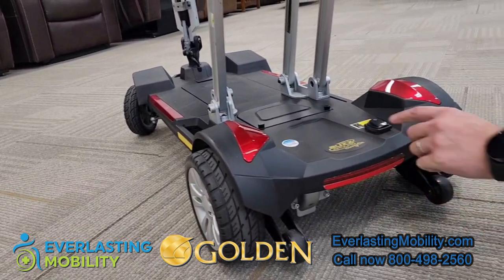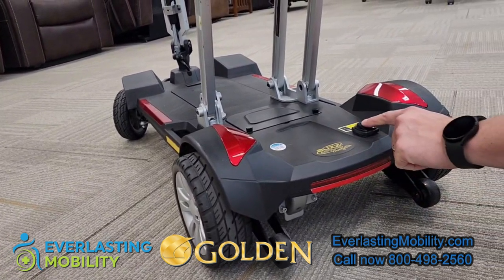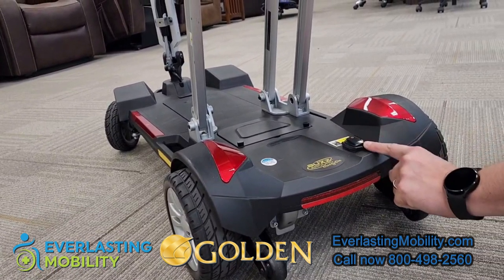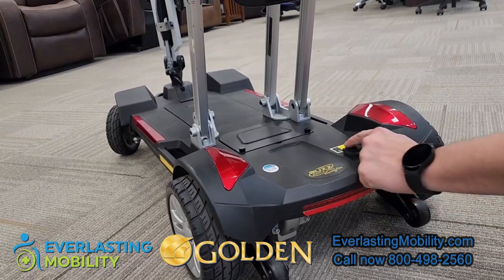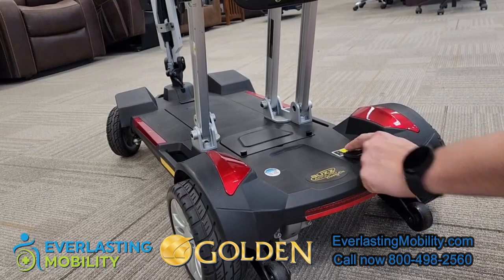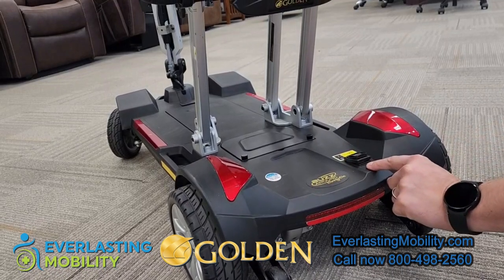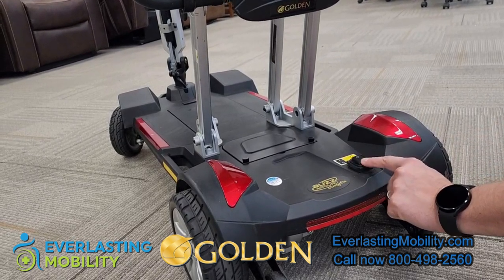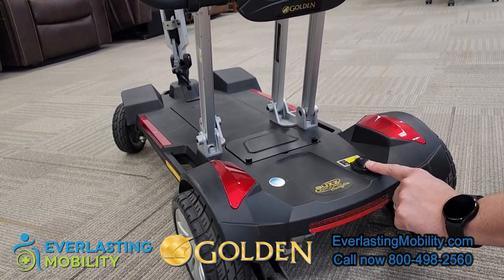This button is the freewheel lever. If it is turned off you cannot operate the scooter, but it will put it into a neutral position so you can push the scooter if you were to run out of battery. If you turn it on it puts it into the drive position, and when it's in the drive position you can operate the scooter. Once you let off the throttle the electromagnetic brakes will engage.